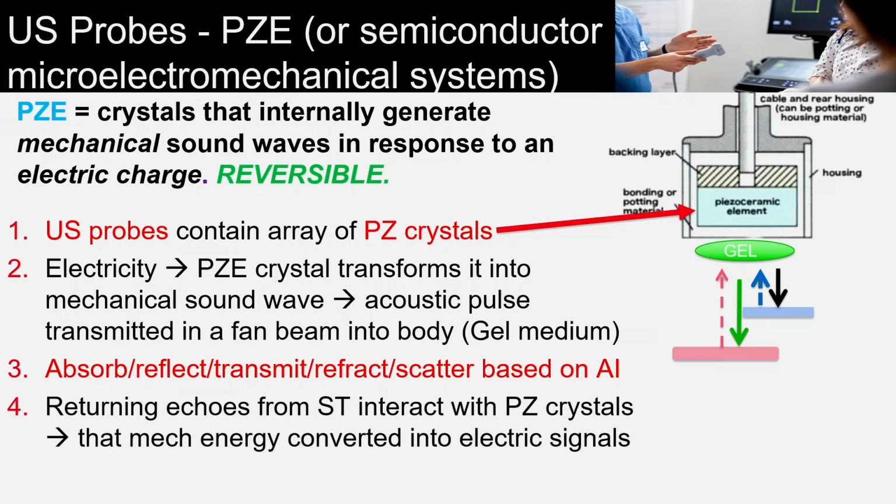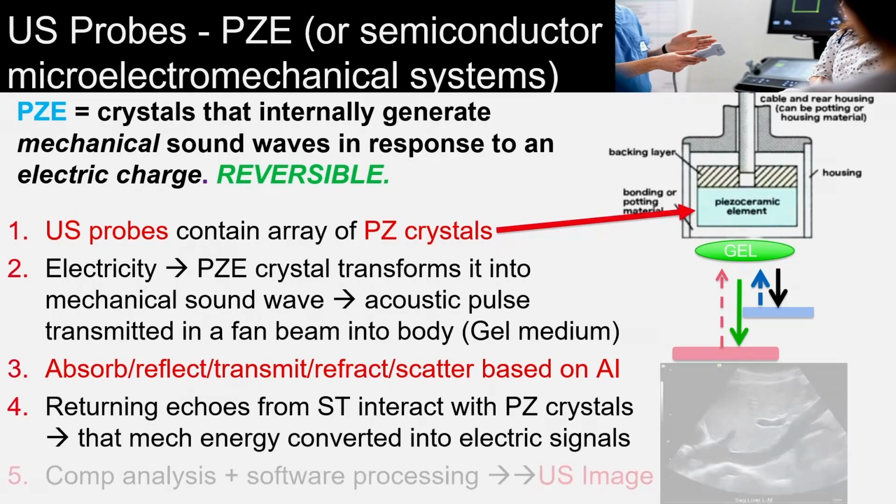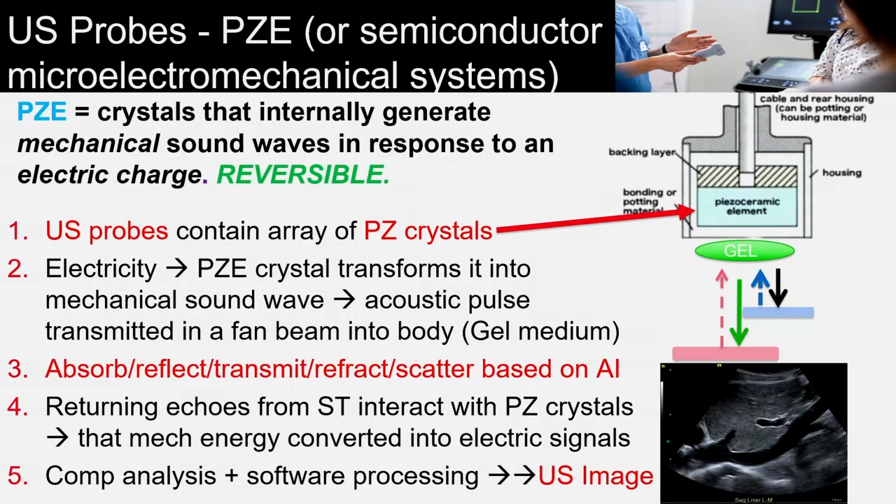In any case, the waves that are then returned to those piezoelectric crystals, reflected or refracted back, are converted from mechanical energy back into electric signals. Then, through complex computer analysis and software processing, an ultrasound image is formed. That's sort of the overview, going from crystal to image.